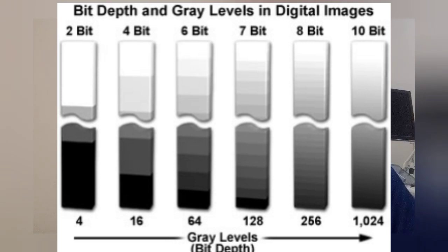But a 5-bit system having 5 layers can store more, because you have 2 to the power of 5, that is 32 values at each pixel. So modern digital memories typically have 7 or 8 bits deep at each address location.